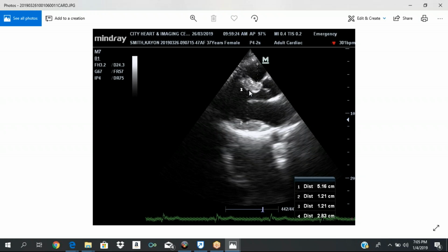So you need to get right at the tip of the mitral leaflet. Now we talk about the plane of the LV. The plane of the left ventricle is like this because the left ventricle is going up. So when you're doing your measurements, this line should be perpendicular to the plane of the LV. So this is how it's supposed to come.